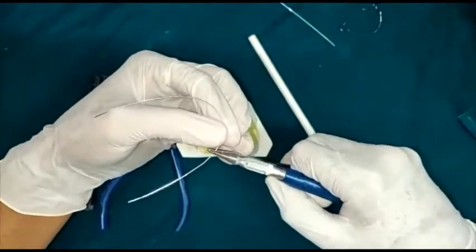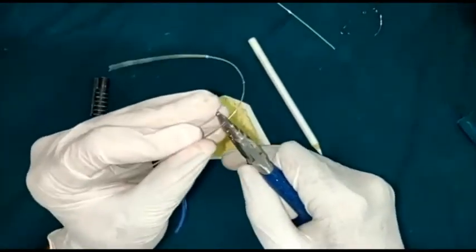From the premolar markings, towards the gingiva, you will give a 90 degree bend.